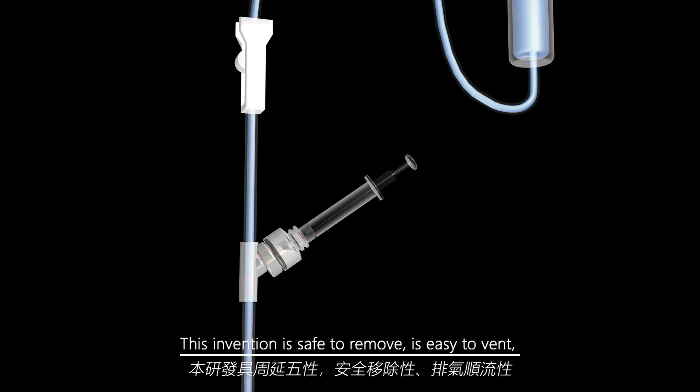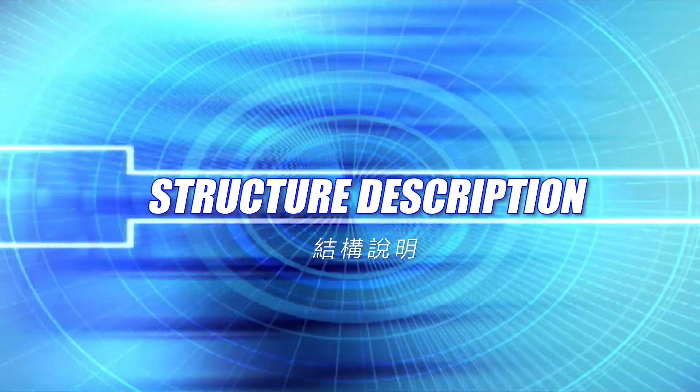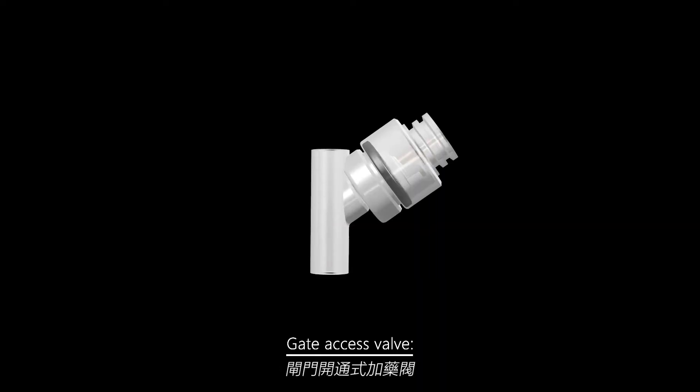This invention is safe to remove, easy to vent, saves time, does not require tapping, and improves quality of care.